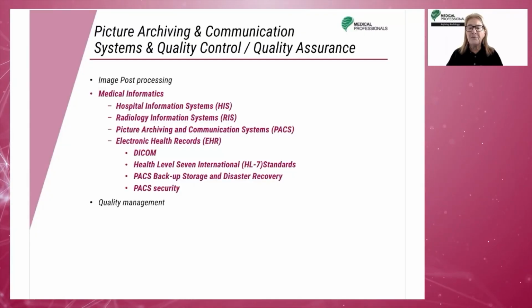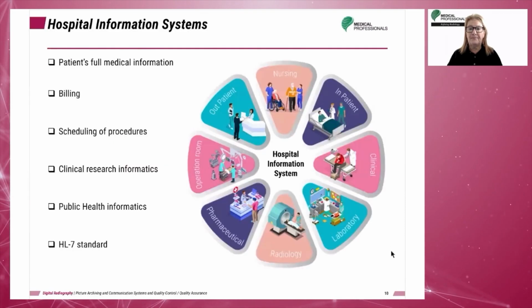Informatics covers a multitude of topics. The ones of most significance to radiographers will be discussed in this particular series. The Hospital Information System, or HIS, houses all of the patient's medical information, including billing, scheduling appointments, and medical records.